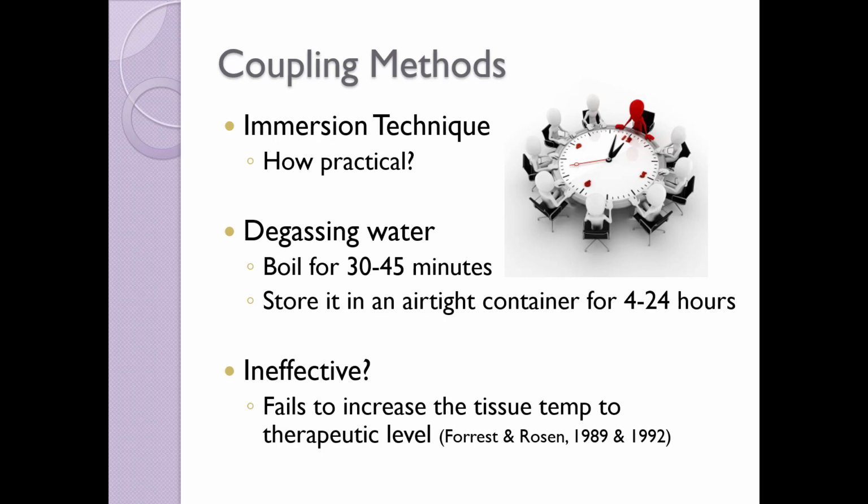There has been some research that suggests that this coupling method may be a lot less effective. In older studies, they have suggested that immersion ultrasound fails to increase the tissue temperature to a therapeutic level. Unfortunately, there have not been a lot of newer studies that have disproved this research or suggested it is more effective.